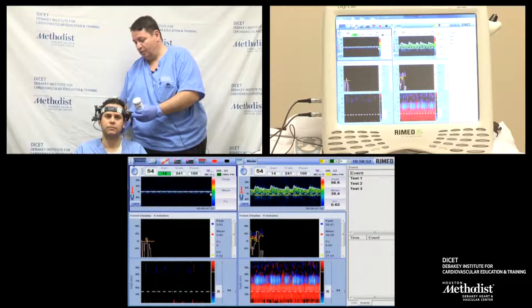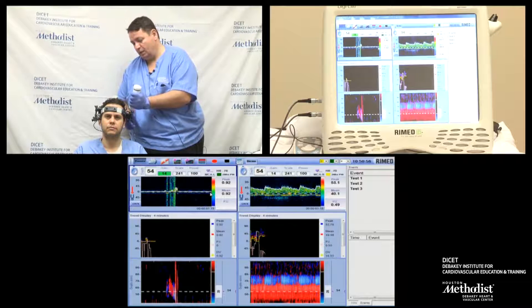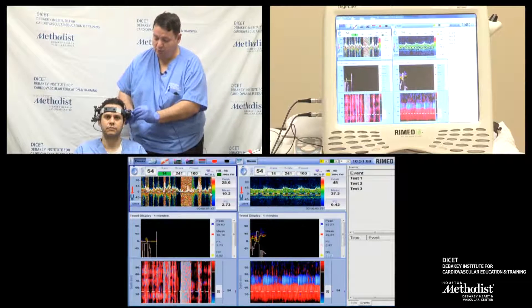At a depth of 60, there are too many vessels, and I can misidentify the MCA by PCOM, PCA, and so many other vessels.